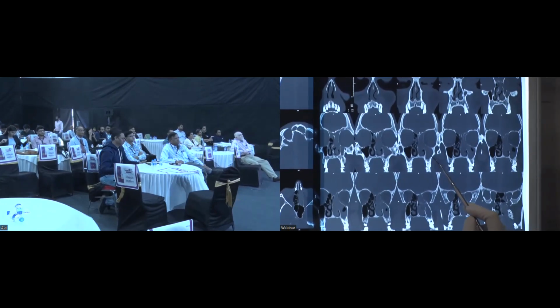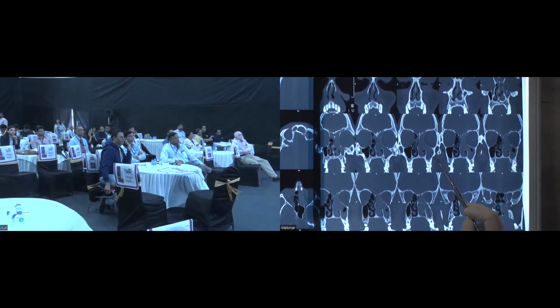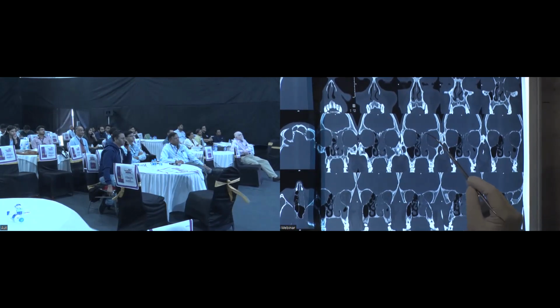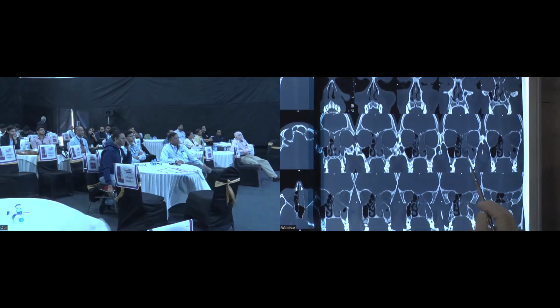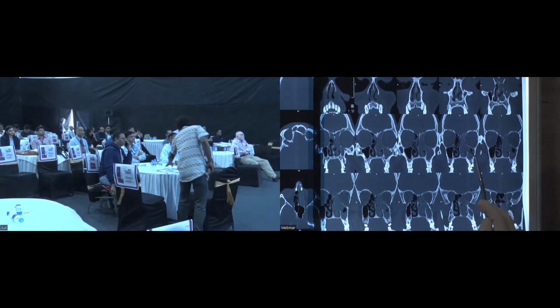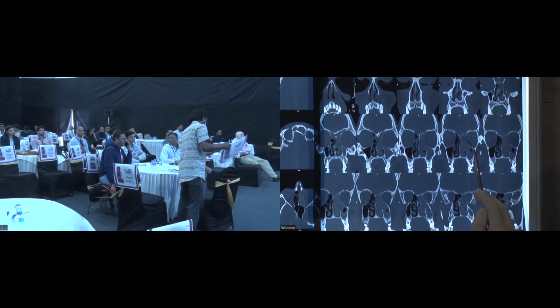We actually did not have DICOM images of this patient, otherwise we would have taken you frame wise. The entire middle meatus is filled up, but post steroid preparation, a lot of disease has been cleared. If you go backwards, you can see that here you have a frontonasal area which is affected.